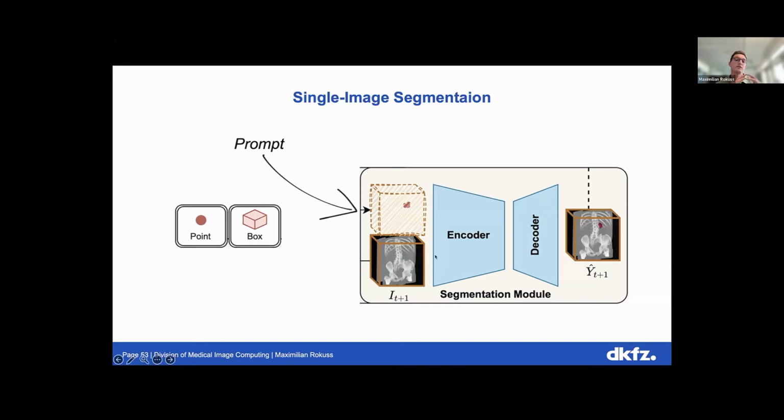And in this case, what we did then is we had a medical image, so it's a 3D volume, and also an associated channel, which we just append to the medical image. And in that channel, we place the prompt. So in this case, the structure is super simple. It is just a UNet, so to say. And this UNet gets a segmentation mask or a point prompt or a box prompt in the first iteration, so basically in this prompt channel, and then the medical image as well.